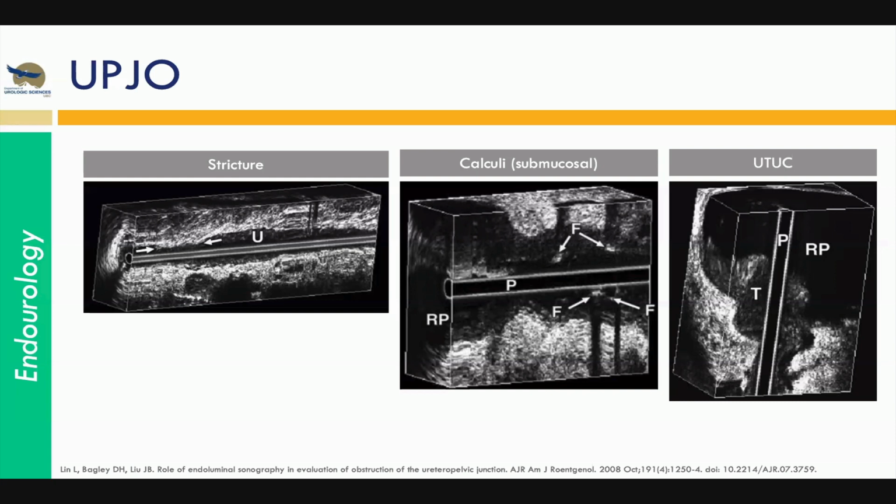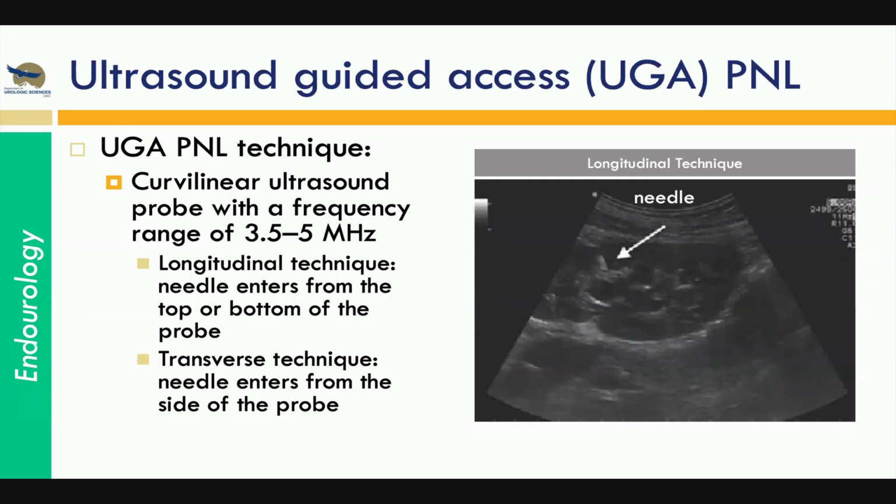I think next, one of the biggest uses of ultrasound in urology is ultrasound guided access for PCNLs. Typically, our stone center, when Dr. Chu and Dr. Patterson do this, is primarily using fluoroscopy, which is the typical technique that most people use, but ultrasound guided access is something that's increasingly being used.